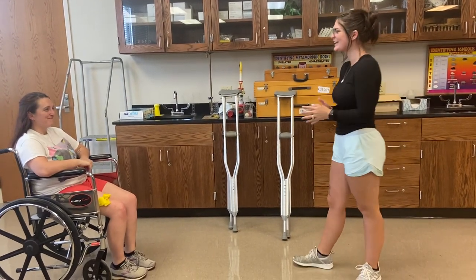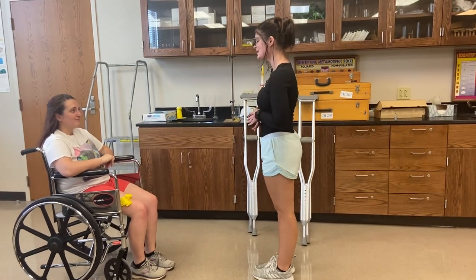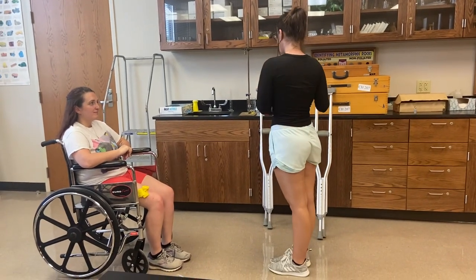Hi Amanda, my name is Kate. I am a student physical therapist assistant. Today I'm going to work with you on some crutches. Is that okay?